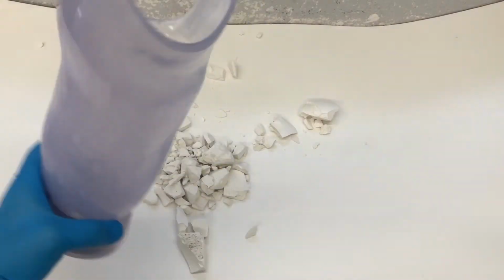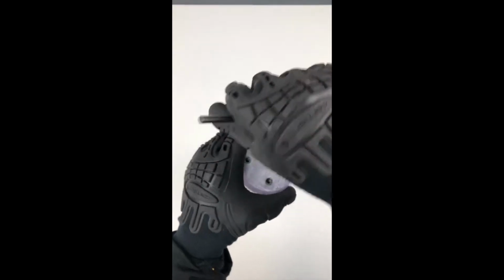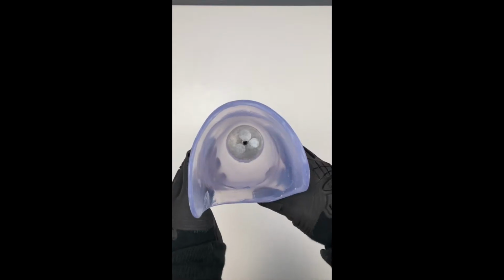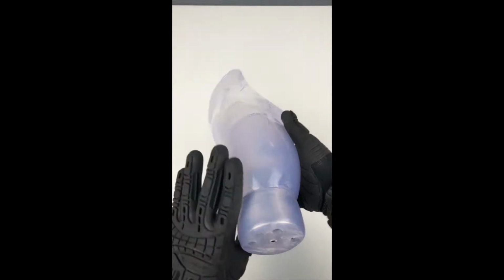Break out the plaster model. Remove all 4 cap screws from the distal aspect of the socket. Verify the thermoplastic conforms perfectly around the proximal edge of the dummy.